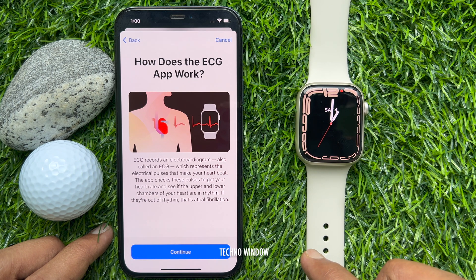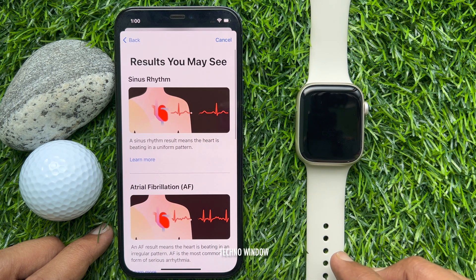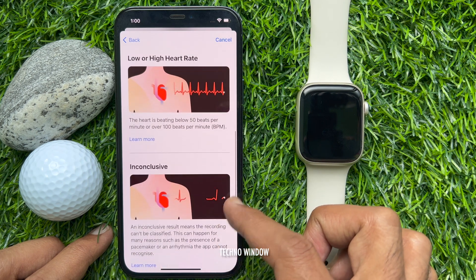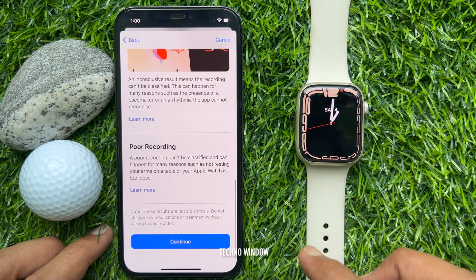How does the ECG app work? Read the information and tap Continue. Results you may see — scroll down and tap Continue.